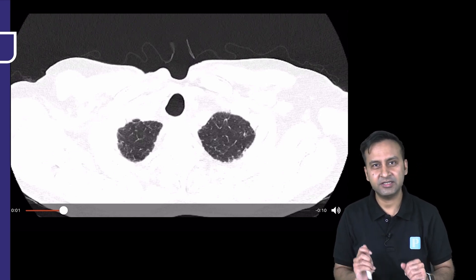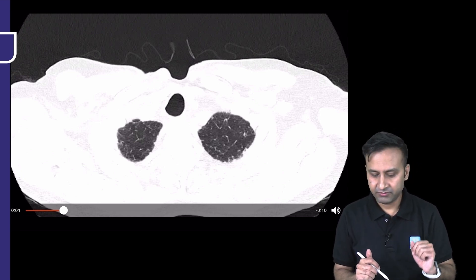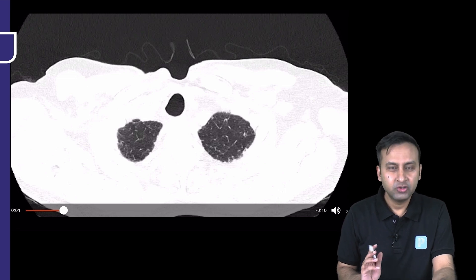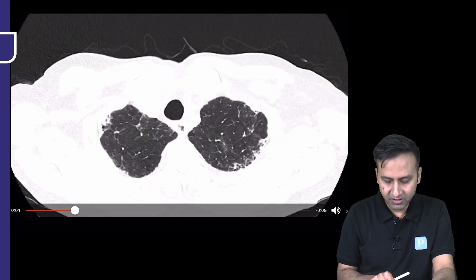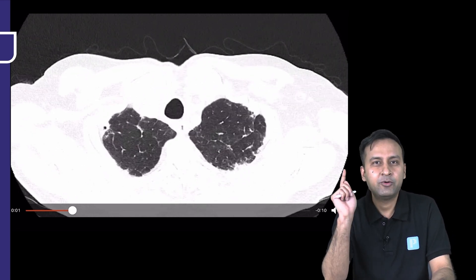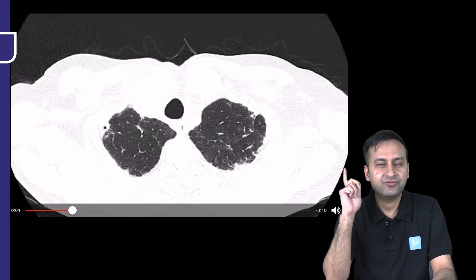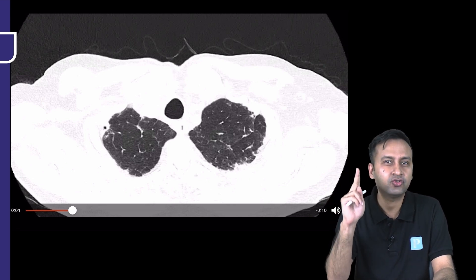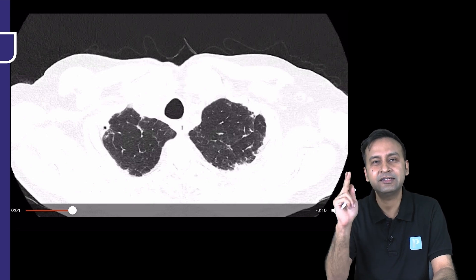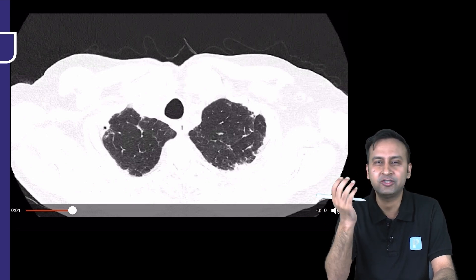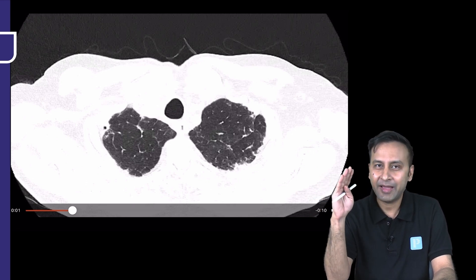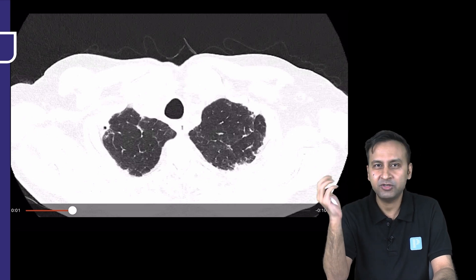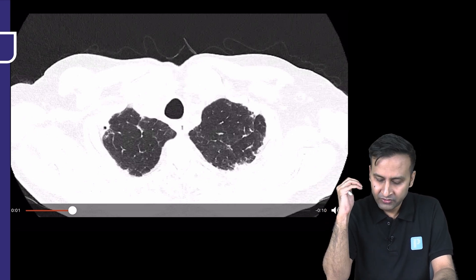Then we'll look at some representative still images from the case as well. When talking about the apices, do you see any abnormality? Remember our discussion on abnormal pathologies in ILDs: first, look for reticulations — lines; second, look for nodules — dots; third, look for ground glass opacity or increased opacification; fourth, look for abnormal hypodensity in the lung parenchyma, which may be due to mosaic attenuation.